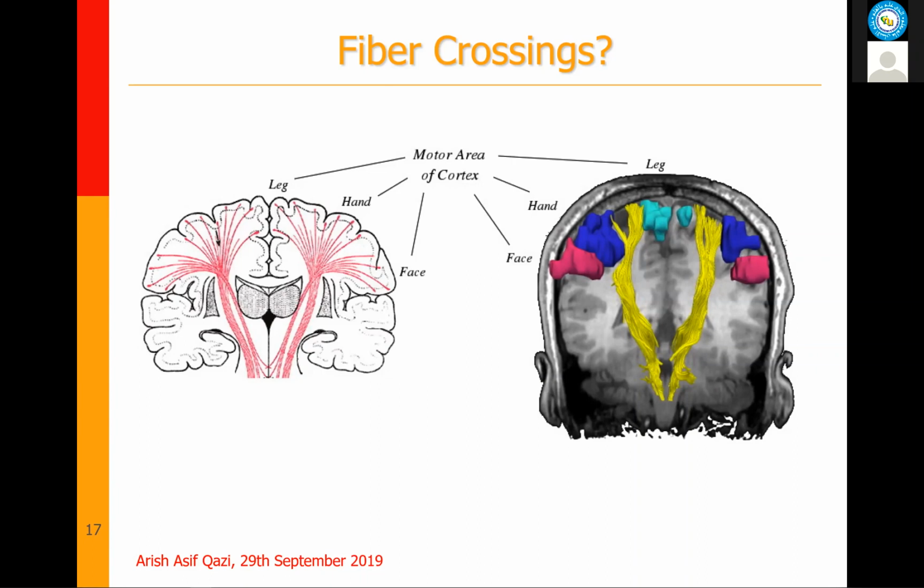This area of the motor cortex is reserved for the hand. This area is reserved for the leg. So the whole idea is, with the standard tractography, we can visualize tracks going to these areas. I'll, in a minute, show you why this is important. As you can see, we know that the tracks should actually diverge over here. Essentially in this area, there are several tracks and they are crossing each other, whereas with the standard technique that was developed early on, it's just not possible.